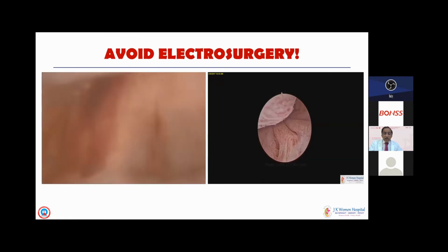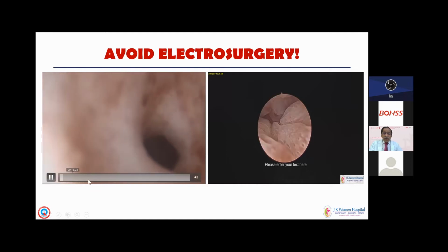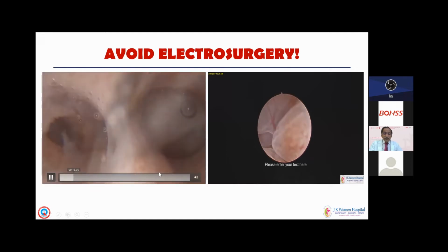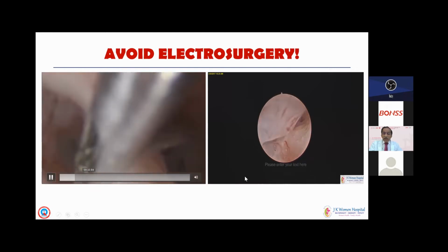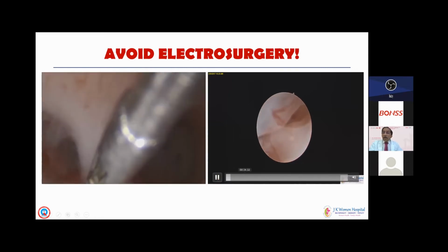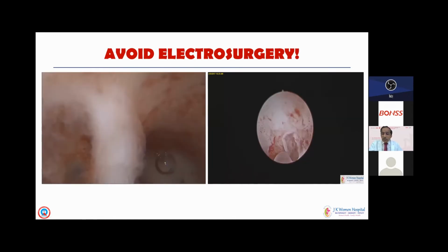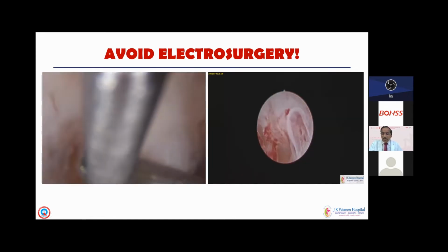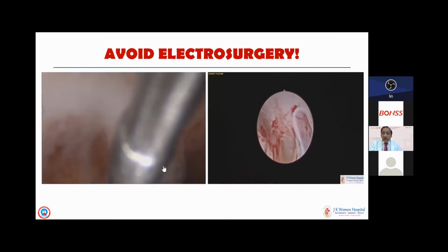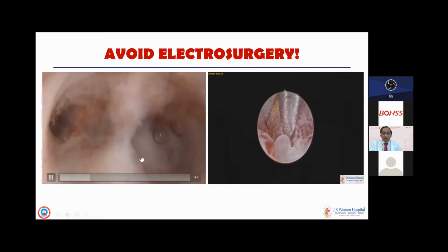Well, you can definitely see that Asherman is one condition. If you pick up early, you are lucky. You have to diagnose that after a particular procedure, if a patient comes with oligomenorrhea or amenorrhea, put in the ambulatory hysteroscope sooner than later. Here you can see on the left side where the anatomy of the uterine cavity is still maintained because you have picked it up early.